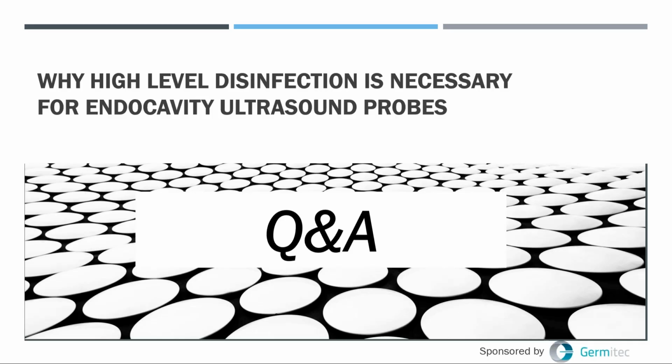What I can tell you is whatever cleaning method you do use, of course, you want to remove any gel that might be on the probe, any visible contamination, so anything that you visually see, meaning mucus, any dried blood, serum on the probe, any discolored areas. All of those should be cleaned, and so the probe should look as completely clean as possible, essentially just like when you purchased it new. And you need to follow the manufacturer's recommendations, both for the disinfection method and the probe, to do that cleaning properly.